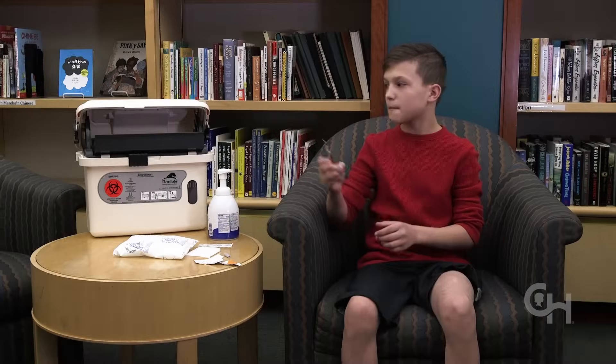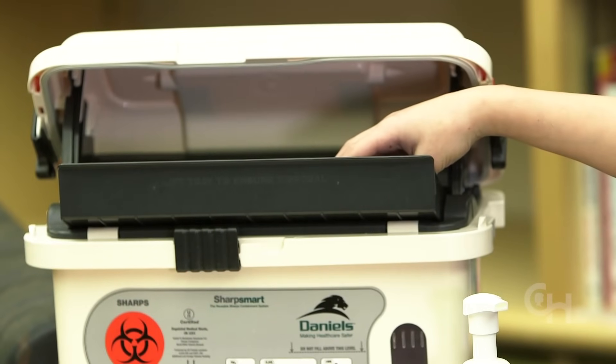Do not recap the needle. Throw the syringe and needle into a hard container. You're all finished — you did a great job, and you should be very proud of yourself.